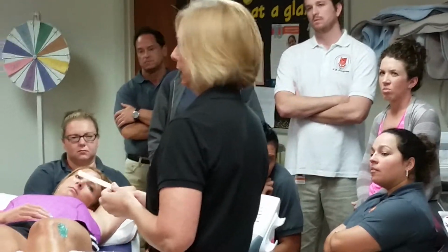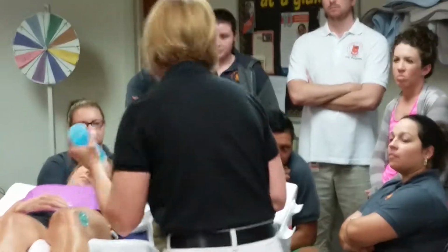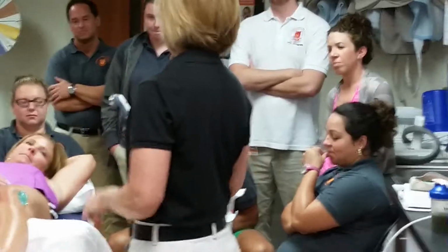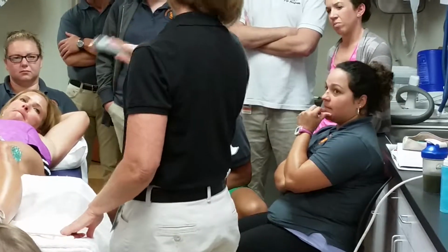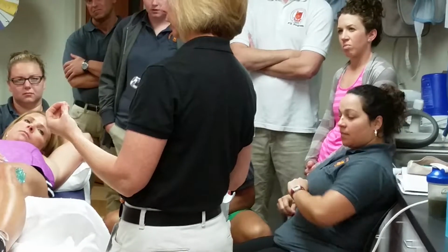I am so right-handed, I can't do it. So I just take my gel, and if I need more, okay? Because I'm not ambidextrous and I can't do the whole maneuver. One of the things you want to be cautious of is don't lift and swirl the sound head, okay? Because again, you're changing the delivery, okay?